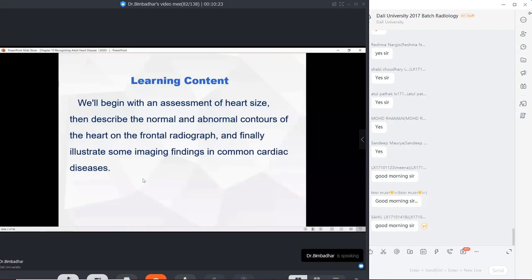But when compared with the chest radiograph for assessing the lungs, and particularly if you are looking at the heart, even if you are suspecting some kind of heart disease, the chest X-ray may not sometimes give you the complete information unless you are familiar with some things. A physician will not be able to learn about these things, but a radiologist will generally know the technique of how to correlate physiology and pathophysiology to the appearances present on any radiograph presented to him. So heart size is always assessed and measured on a frontal radiograph.